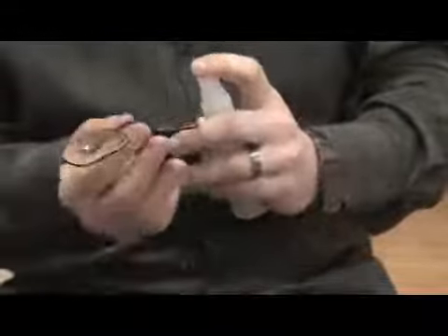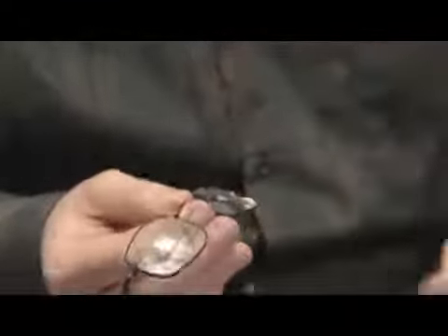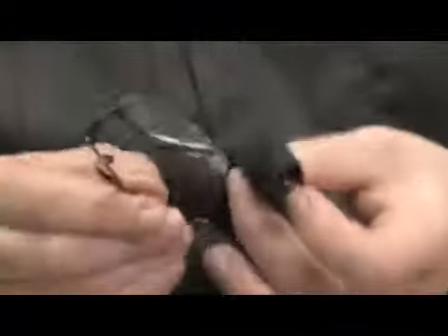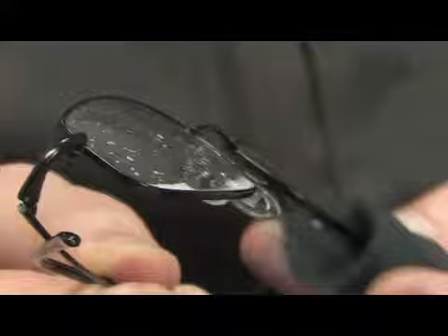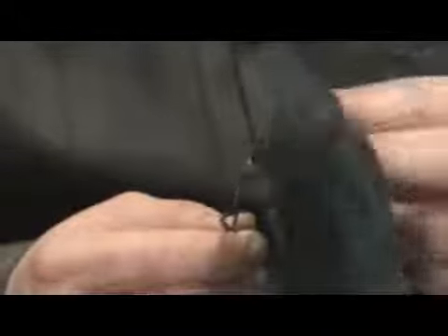So what you want to do, and you could do this, you could spray it on the cloth or you could spray it on the lens. I prefer to spray it on the lens, okay? And again, what I would do is fold the temples up and go from the interior over. So circle around the exterior and then go through the interior. And then once again, same thing.